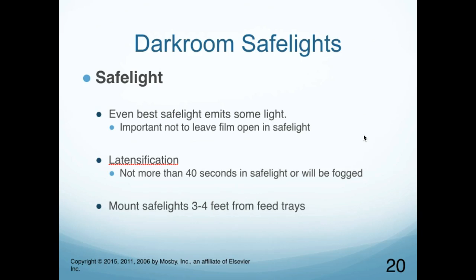So basically the safe lights are mounted about 3 to 4 feet away from the feeding trays. Enough to where you can see it, but not enough to expose too much.